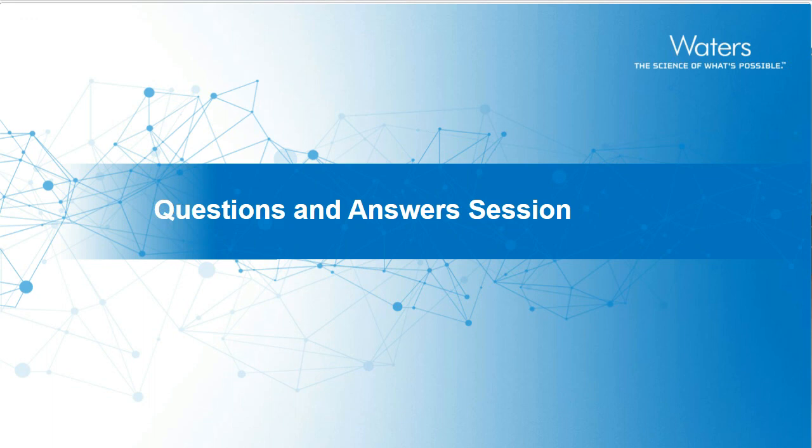Okay, thank you for that. There's a question on the RADIAN. Can you perform quantitative analysis on the RADIAN? I've only used it in a qualitative mode. I wouldn't consider it to be a quantitative instrument. However, I think it might be possible to do semi-quantitative work if there was an internal standard added to the sample. As of yet, we haven't tried that. I think I've recently seen some publications where people have added an internal standard at known concentration, so maybe I can forward those.